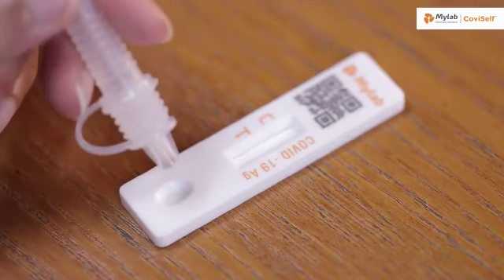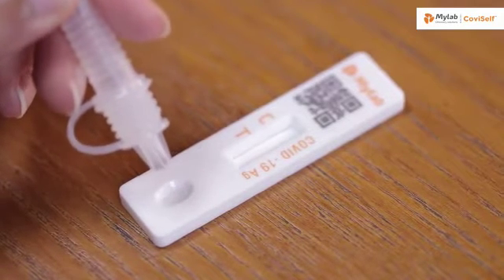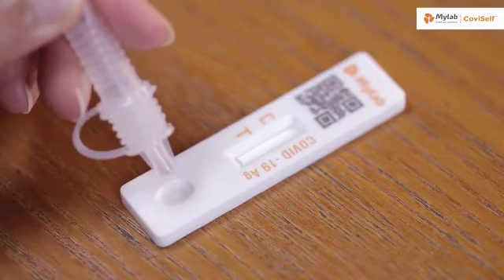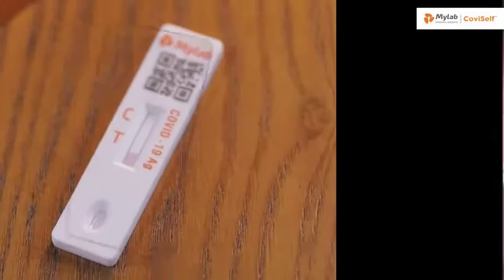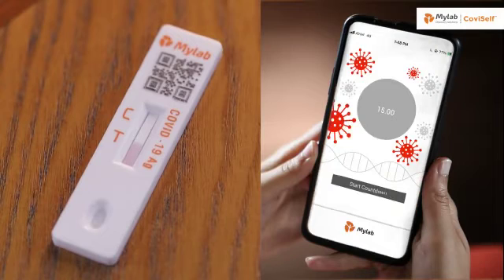Take the test card and add 2 full drops into the well by pressing the tube. Wait for 15 minutes for the results to appear. Any results appearing after 20 minutes are considered invalid.